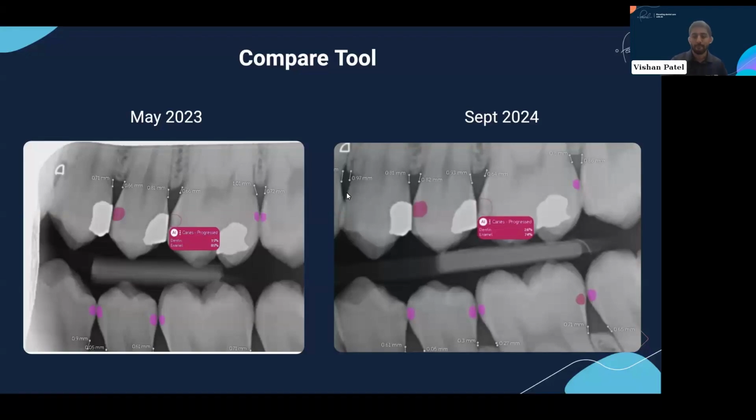And I guess those incipient caries, those light pink coloured detections, are also prompting them to book their hygiene appointments more regularly then. Exactly, hygiene appointments, to get some fluoride mouthwash, to start TePeing and brushing, because they know that these things could turn at any point. So that's why the colour is great for a patient to see.